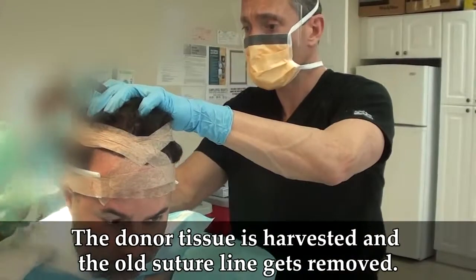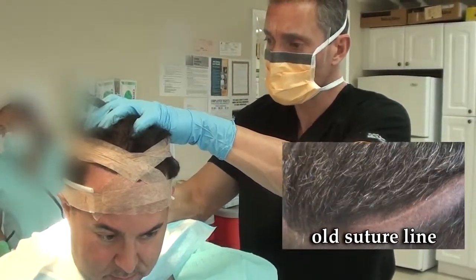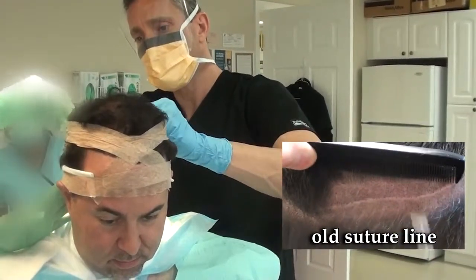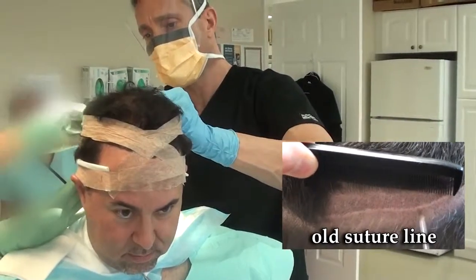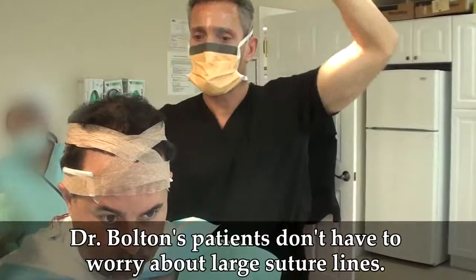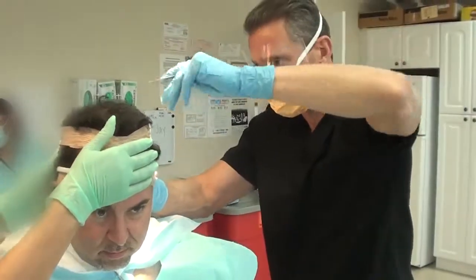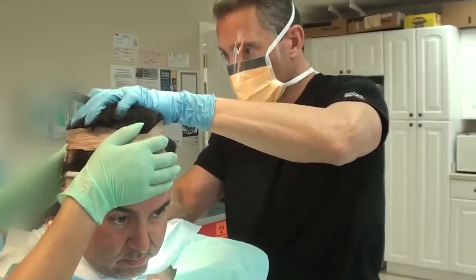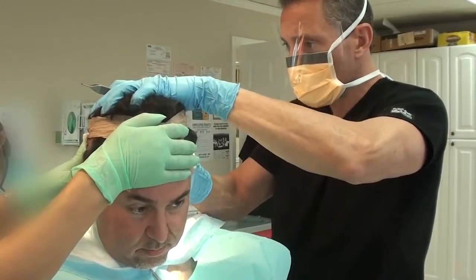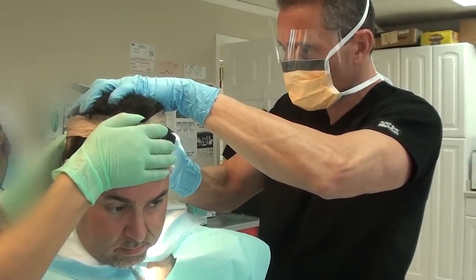Right now what we're doing is we're harvesting the donor tissue. We're excising the old suture line, so that way we're going to leave Jay with just the one suture line. So even though it was a great suture line, we're going to remove it. That way if Jay chooses to cut his hair short, he'll just have the one trace line, which a lot of the guys today are so concerned about. Suture lines, which for the life of me, I don't understand why, but I get it. But at any rate, all we're doing is just harvesting the donor right now.